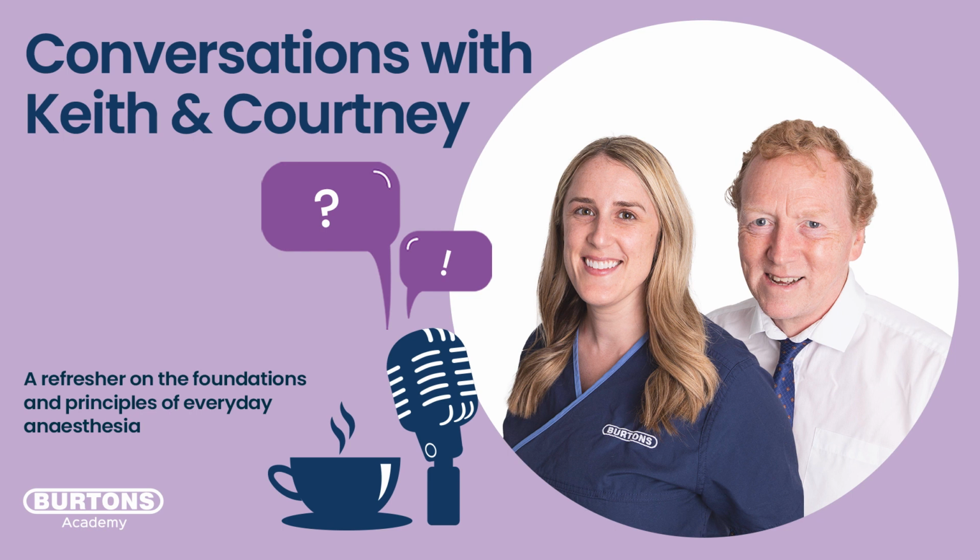Yeah. So I think maybe we'll just talk a little bit about compliance now, because that's what determines what our volume does in terms of pressure. And compliance isn't a concept that comes easily to lots of people. So we need to have a think about what it means. You can't measure it. You can't get your animal in pre-op, listen to it with a stethoscope, squeeze its abdomen, weigh it, or do anything that will tell you what the compliance of that chest is.